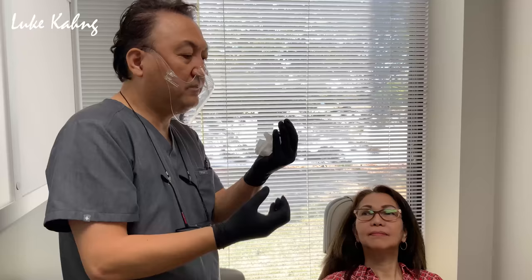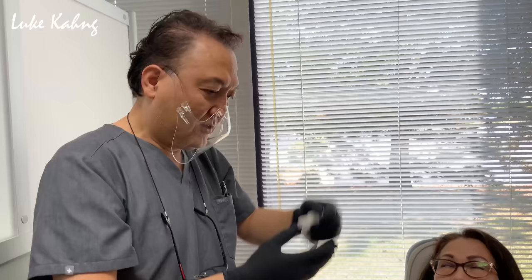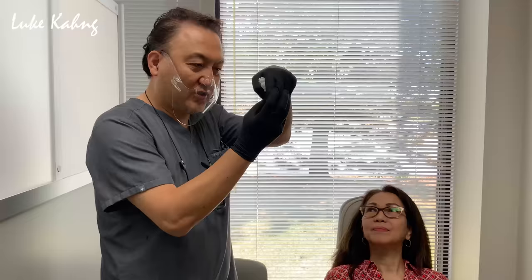So I trim here at the borderline, which she says is bothering her a little bit. Sometimes if I grind too much, I lose the suction. Oh, okay. So you need the retention. So the gum and the denture have some retention, so it's not falling down. So when you go dating with someone, this denture does not drop off. Oh, okay.